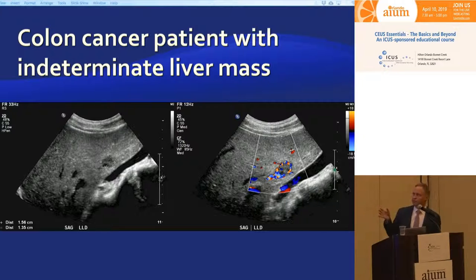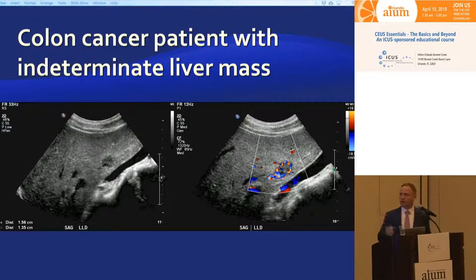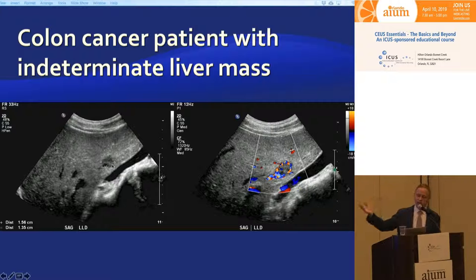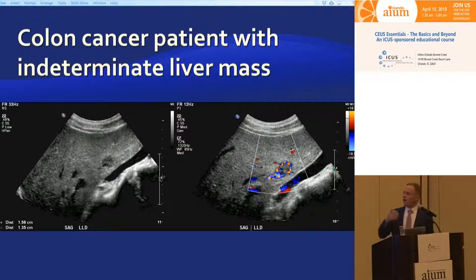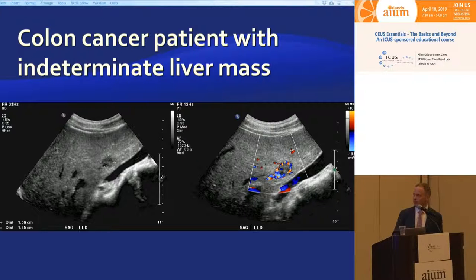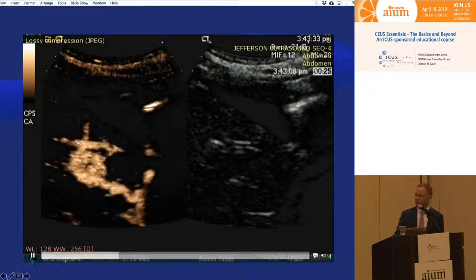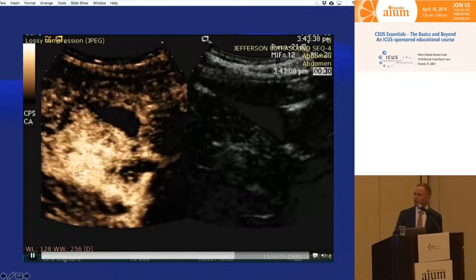A patient around 45–47 years old had a colon cancer removed after colonoscopy and was enrolled in a clinical trial. He had a contrast allergy on CT and was claustrophobic so couldn't get an MRI — he was sent straight to biopsy. On ultrasound there was a hypoechoic lesion with a hypoechoic halo, classic targetoid appearance of colon cancer metastasis. However, color Doppler gave me pause because colon cancer mets are usually hypovascular and shouldn't have such massive blood flow, so we proceeded to contrast-enhanced ultrasound.